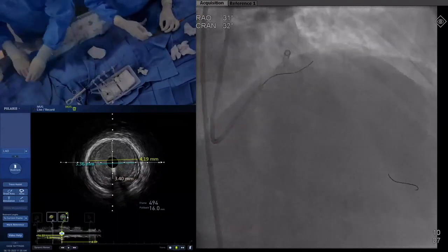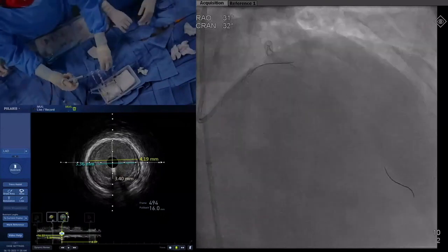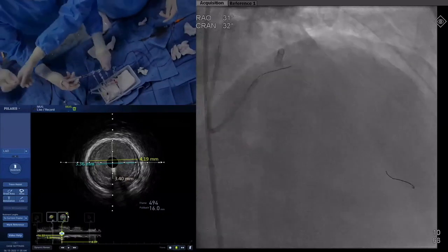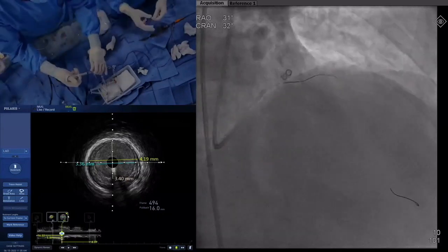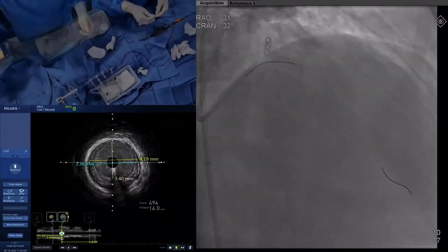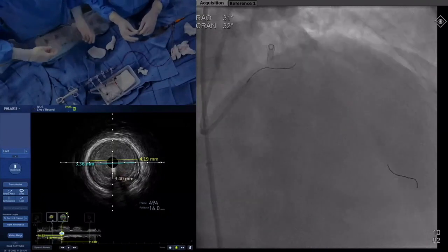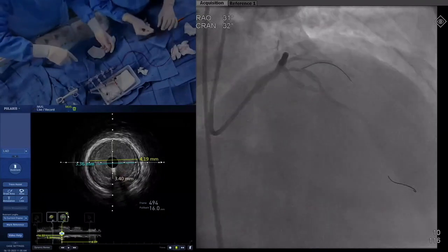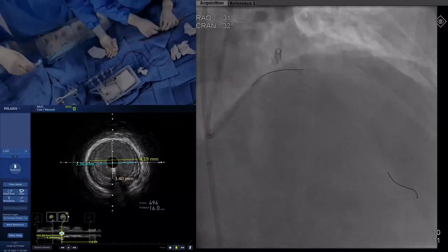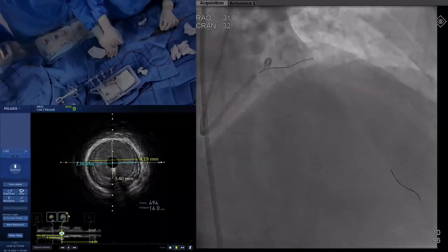Good. Everyone agreed to that? How do you like that strategy so far? Dr. Colombo likes it. Everybody likes that. Okay. Would you just open the side branch to see what's going on, but you are planning for a full 2-stent technique here? And if you were not, you would still be using a cutting balloon, Antonio, even if you're not? I think for this ostial lesion, cutting balloon is good. Okay, good.